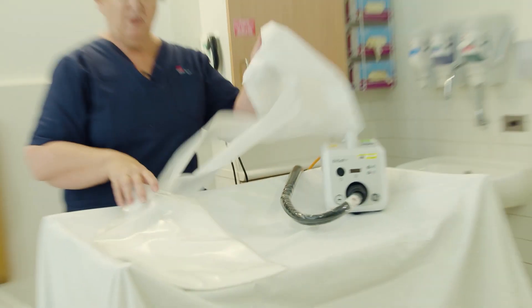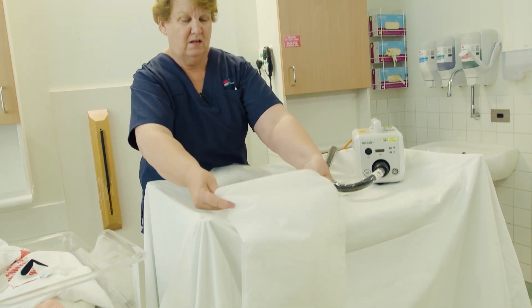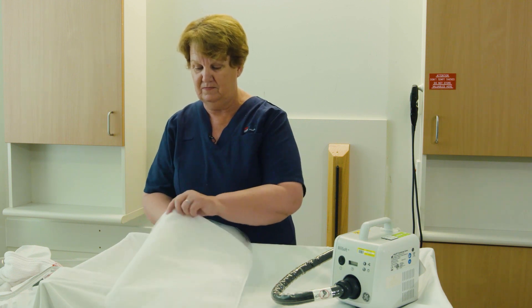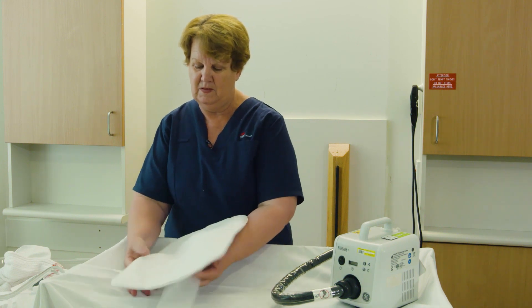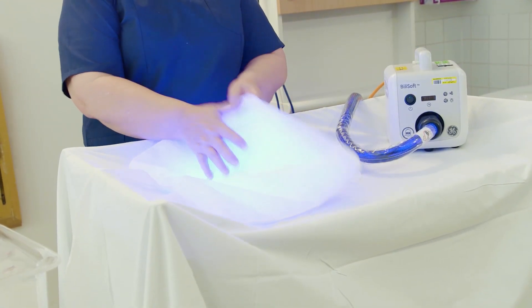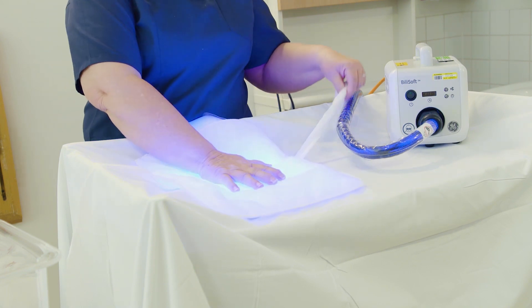There is a cover for the BillySoft pad. The thick side goes towards your baby with the ribbons to the back. If you were to switch the machine on, you can see a bright side and a dull side. The bright side goes towards the baby's skin.